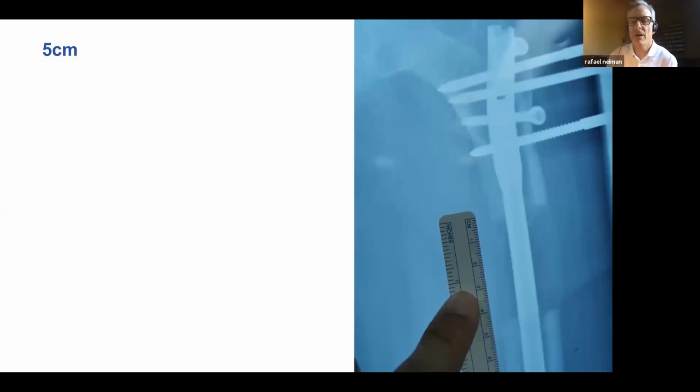So she's going along, cooking along with her monolateral fixator. And then at about 3 months, she has a low energy slip and fall, and she ends up with this. It really accentuates how much force was on this distraction, Steve, don't you think, with that now very varus alignment? Yeah, I do. It also shows the amount of bend that these pins have, a very long lever arm. When she fell, it was enough to bend them and crack against there.